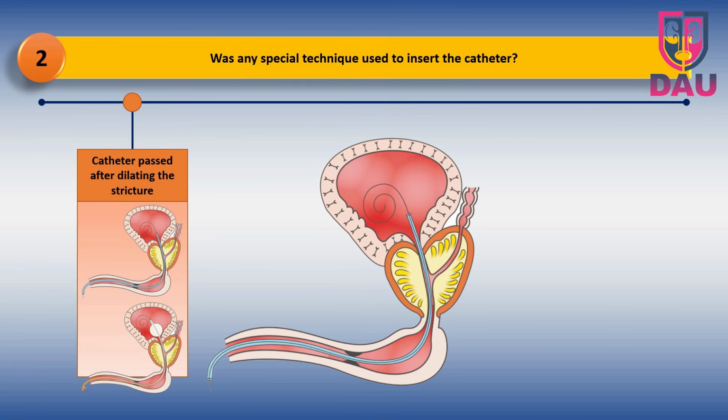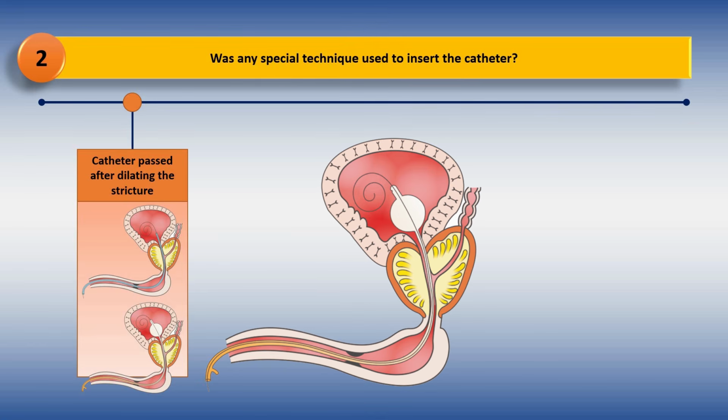Now you want to remove the catheter. Suppose after removing the catheter, the patient goes into urinary retention again, and now it is your responsibility to reinsert the catheter, and you do not have adequate equipment or adequate backing of theater, and you are not trained to place a catheter by using these techniques. So before you put yourself in a trap situation, you should know better what actually happened when the catheter was put in.